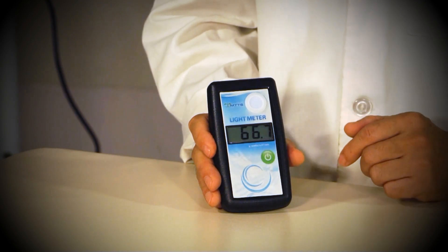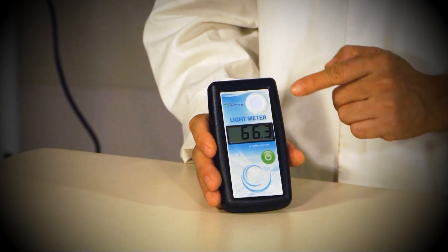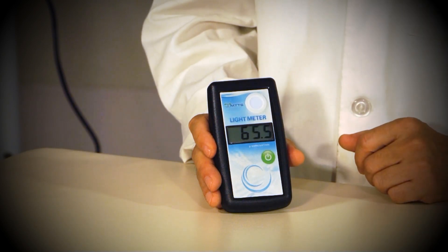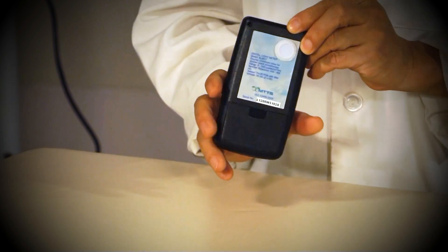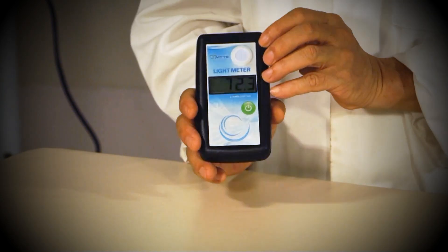If you are measuring a single-sided phototherapy machine, the light meter will measure the light intensity using this sensor. If you are measuring a double-sided phototherapy, the MTTS light meter reads the light intensity from both sides using the sensors on the front and back of the device, and will display the sum of the values.